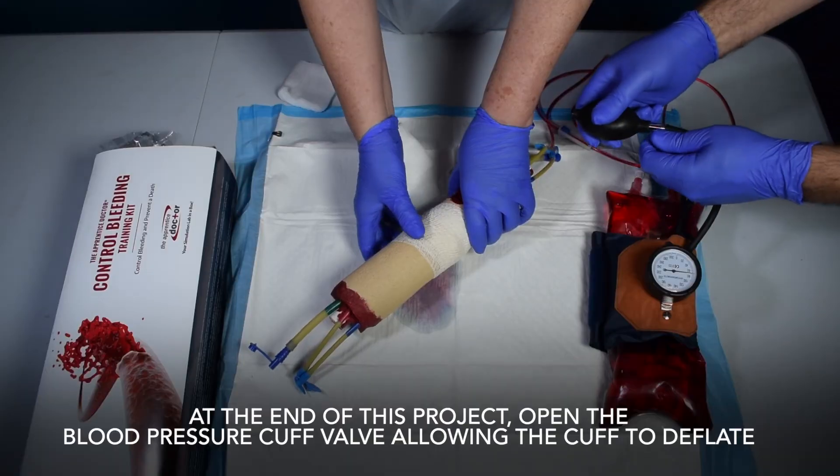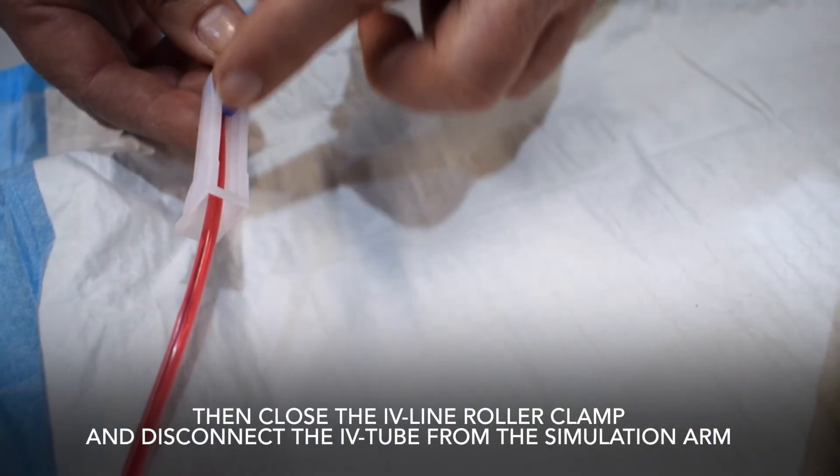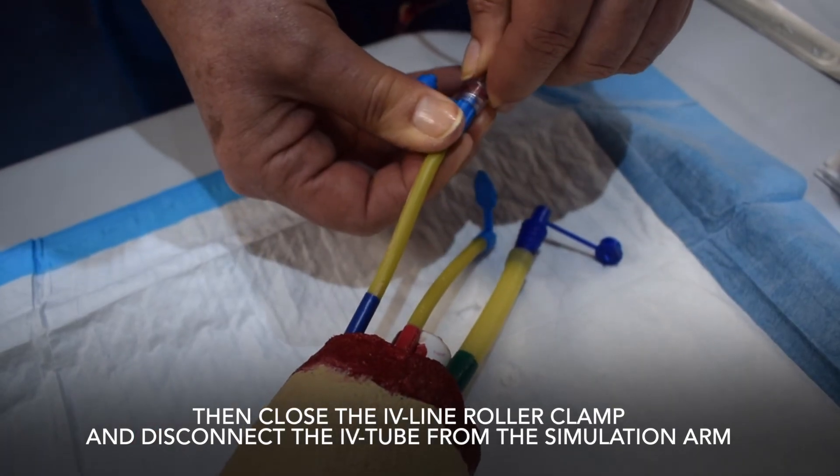At the end of this project, open the blood pressure cuff valve, allowing the cuff to deflate, then close the IV line roller clamp and disconnect the IV tube from the simulation arm.